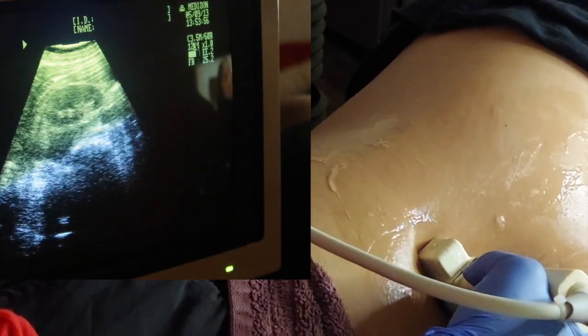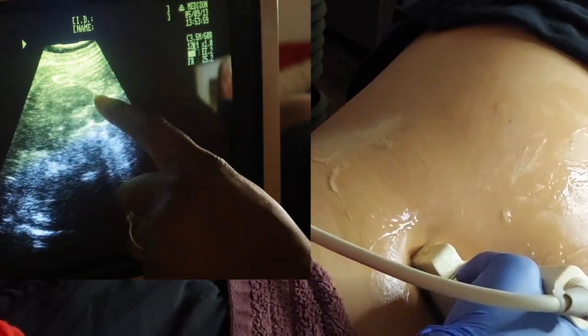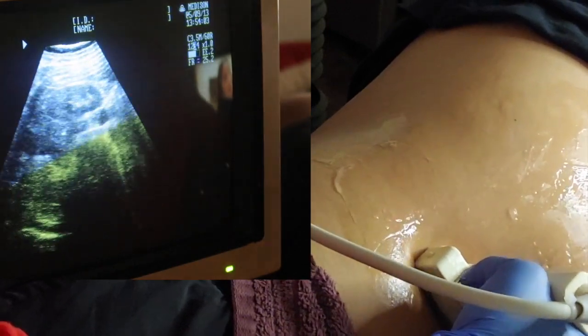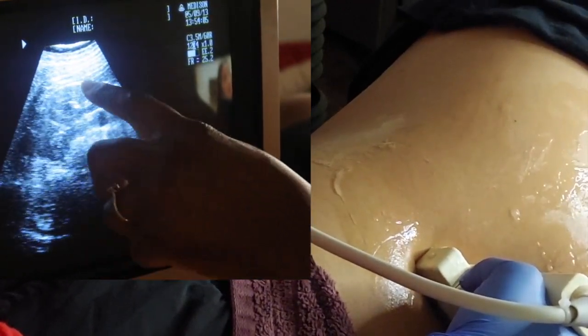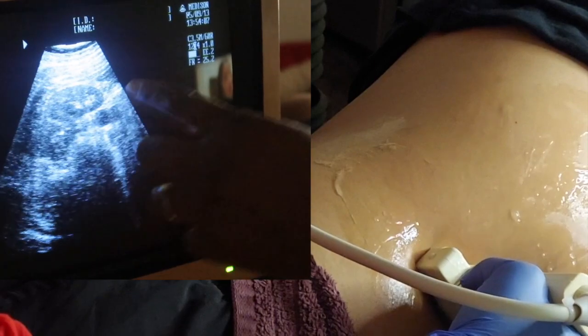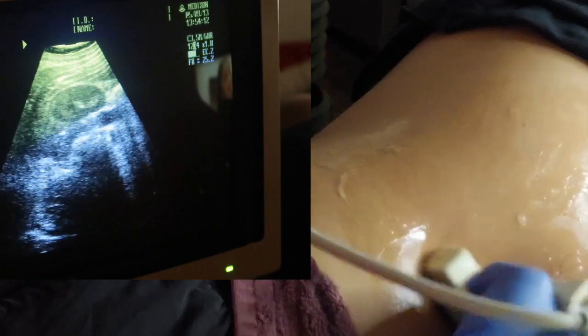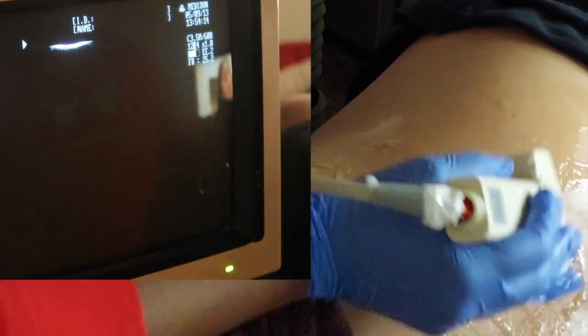Move down just a little further. You want to make sure that your borders are nice and smooth. When you do the inferior, you kind of want a nice circle. And that's how you scan kidneys.